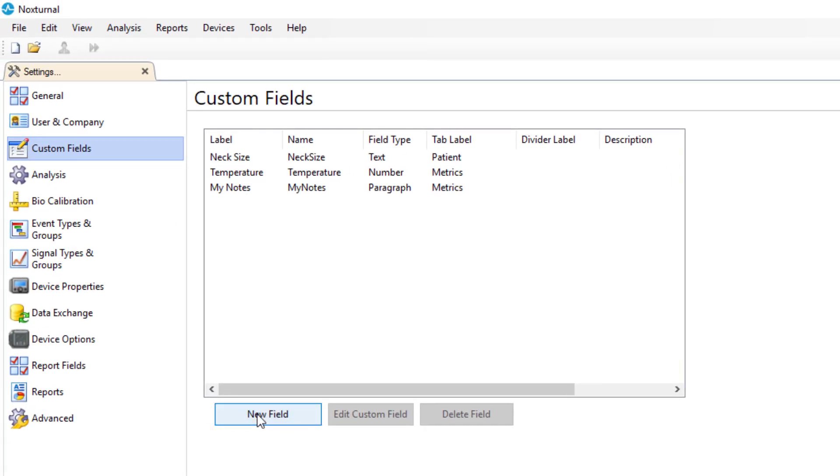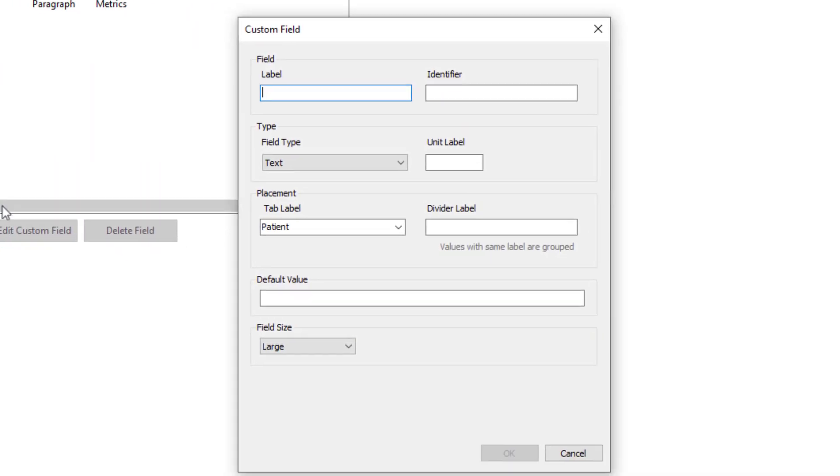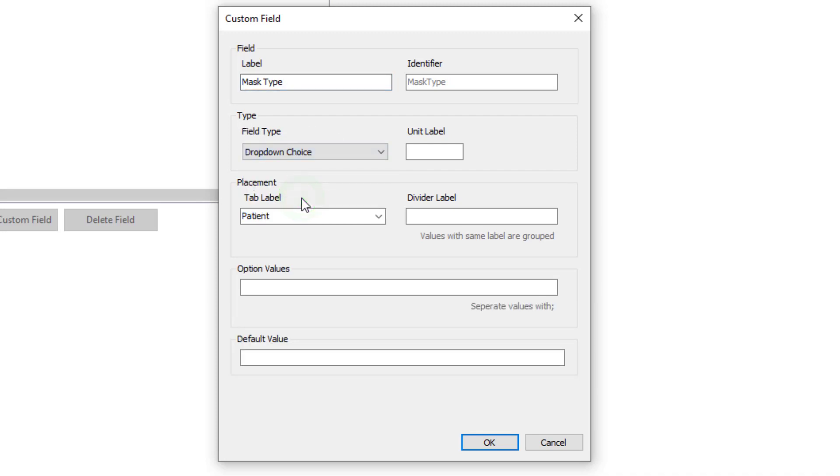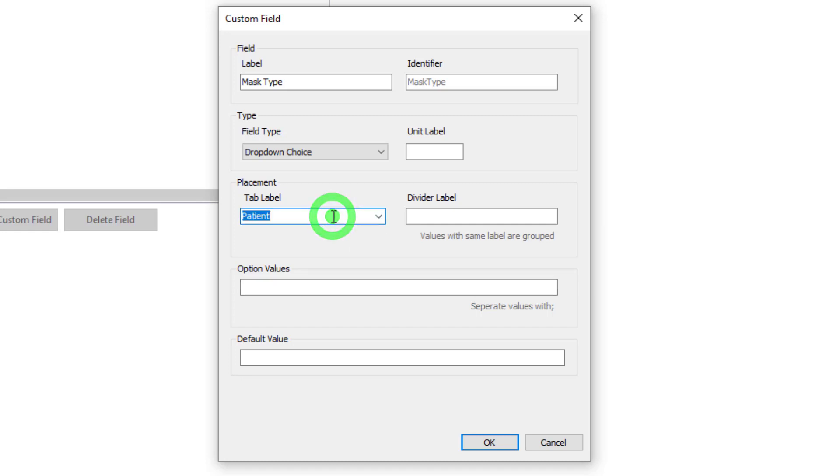Again new field. This label we will say mask type. The field type will be a drop down choice and with drop down choice you see that it will open option values and default values. We're going to again put this in metrics.